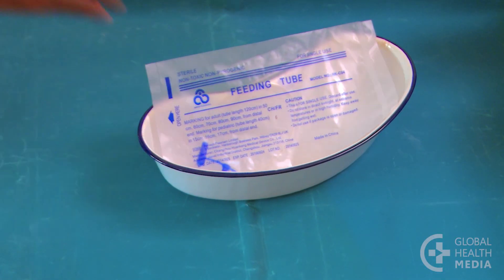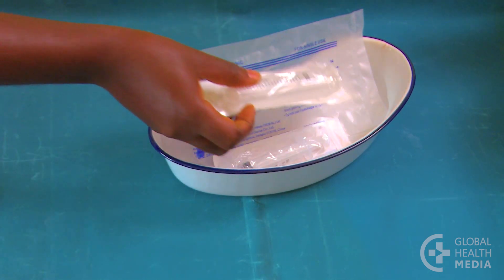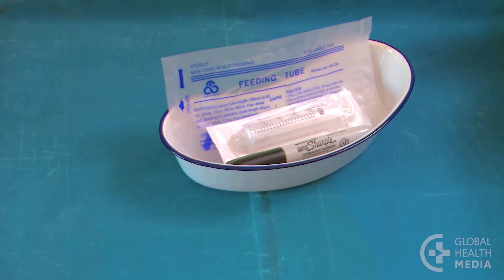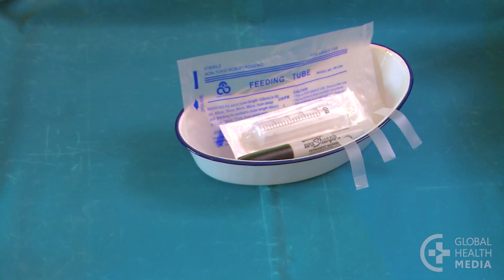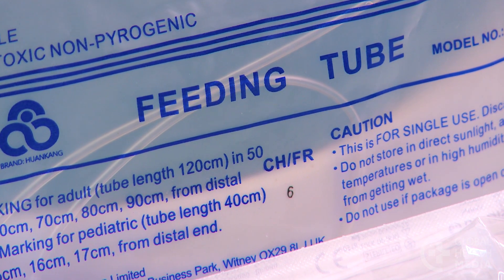Assure the mother that this is safe and will not hurt her baby. To start, gather the nasal gastric tube, a five milliliter syringe, a feeding syringe, a marker, and tape. A five or six French gastric tube is best for a small baby.